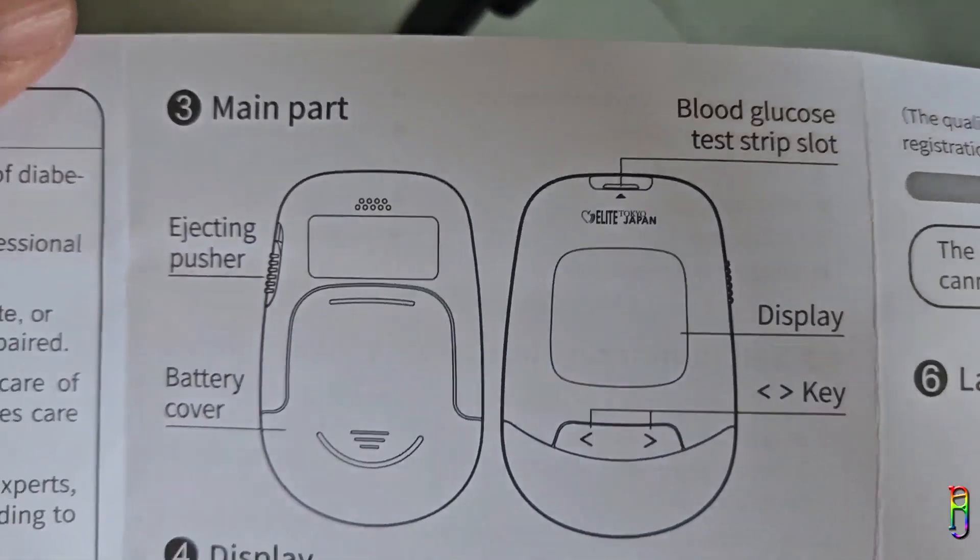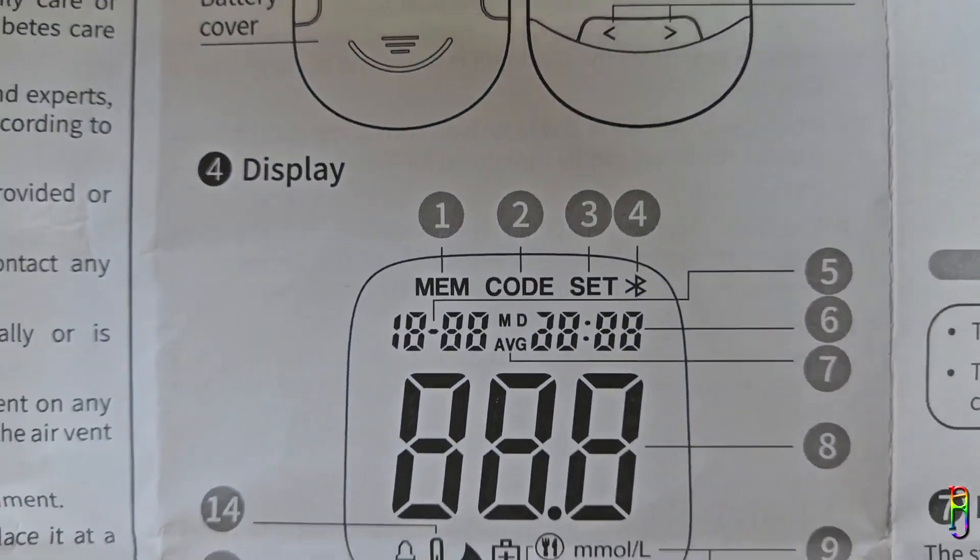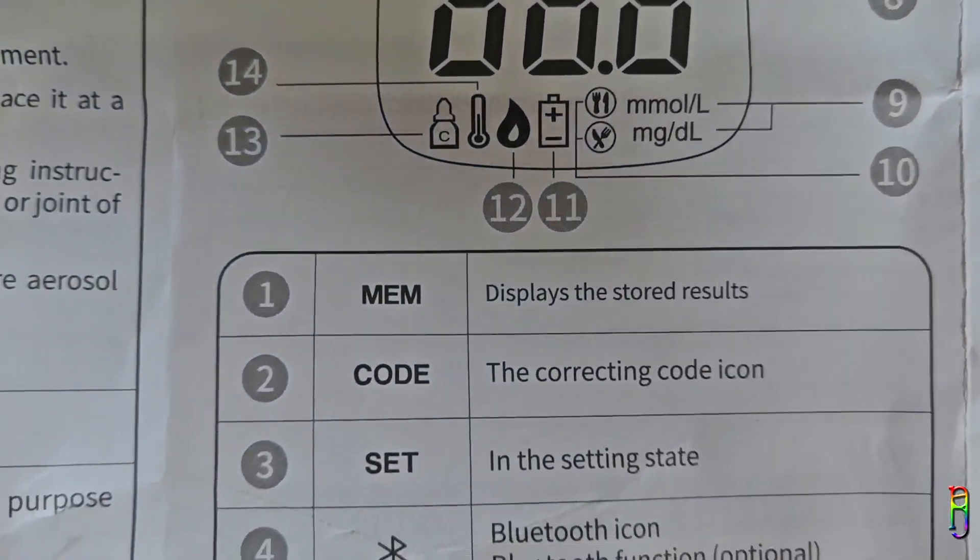Before we set up the device, here's a quick scan of the user manual to get you familiar with the parts and what the display on the screen means.